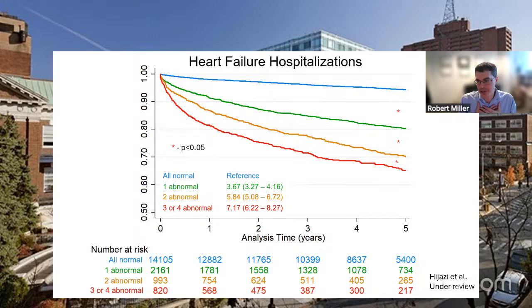I'm not sure about your lab, but at my lab, I get a lot of referrals for dyspnea, like people think maybe it's anginal equivalent. So this is a way that you could provide the referring physician with additional information that would say, hey, maybe you should think about heart failure just because his left atrial volume is high or his LA and his RA volumes are quite high. So it's information that's there. It's freely available, could be given, we're just not using it.